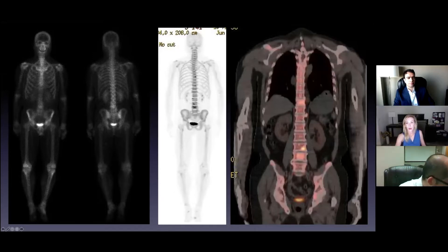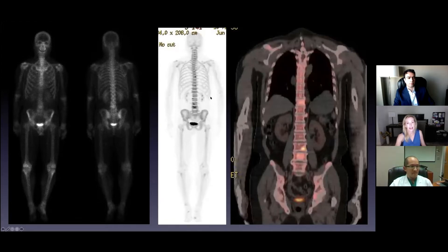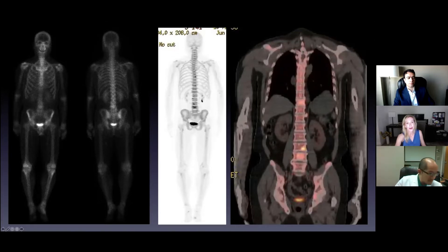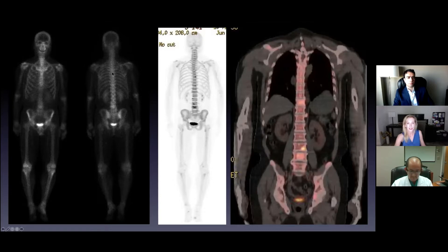This is a PET scan. On the right is the typical PET scan you'd see with color, but this is the black and white version. I made this picture because it looks almost exactly like a bone scan, except see how well you can see every metastasis here — it's like a bone scan but better. The PET is of course a lot more expensive and harder to get. It's not the fast, cheap exam like the bone scan is. But if you can get this, that's great. We like them colorized — the tumor shows up a different color. FDG-avid metastases here. There are multiple and they're yellow because they're hot — a lot of FDG avidity with that prostate cancer.